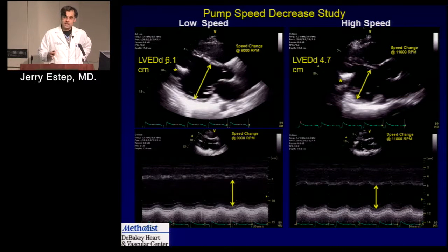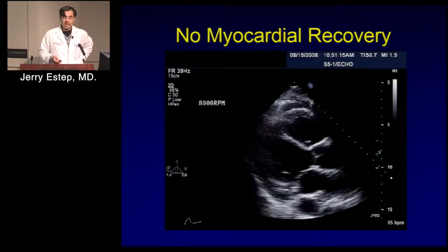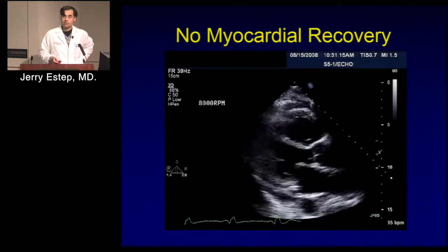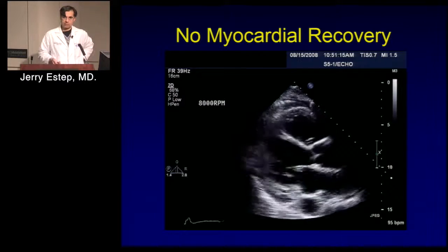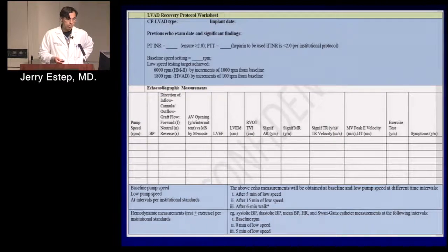Because if we see that at baseline imaging, before taking them to the cath lab and exercising them, we'll just lower their pump speed to see if their heart dilates and if their function changes. Because if we see that they failed, we no longer proceed with the echo recovery protocol. So, for example, this patient at the lowest pump speed with a HeartMate 2, with the valve not opening, function still poor, you want to ensure blood pressure is stable, we're done. We don't need to go do anything. This heart hasn't recovered in a robust way.